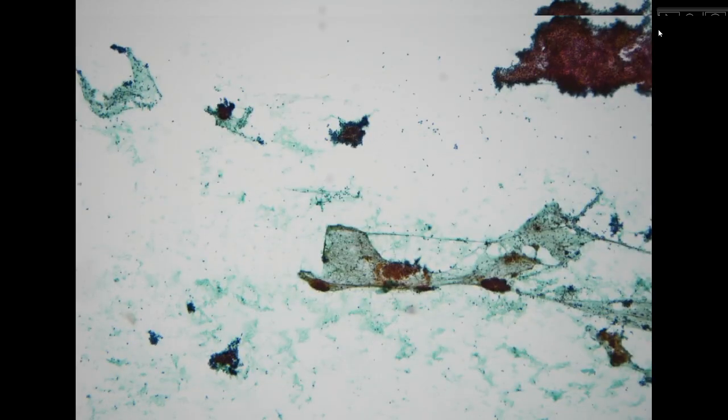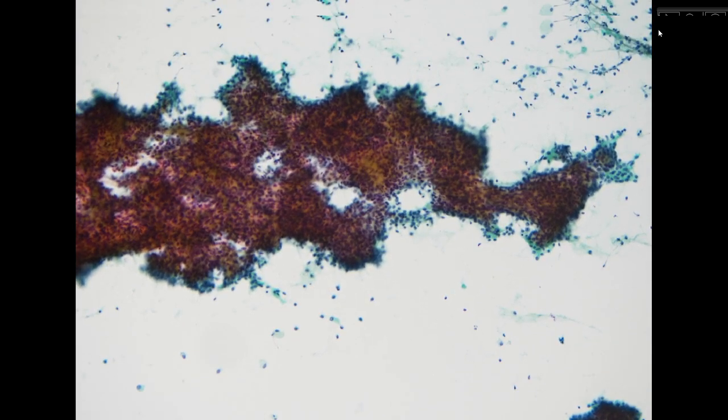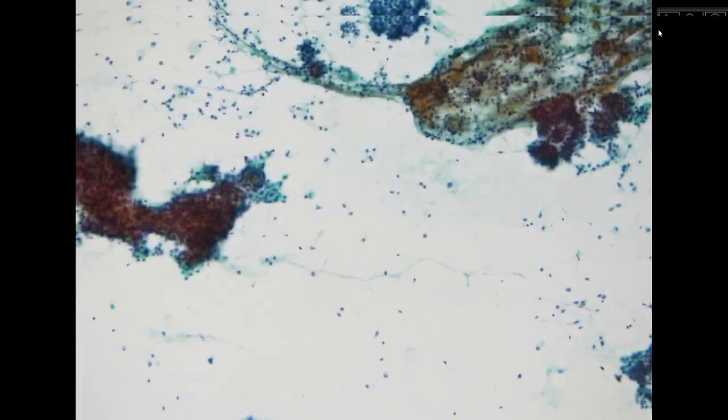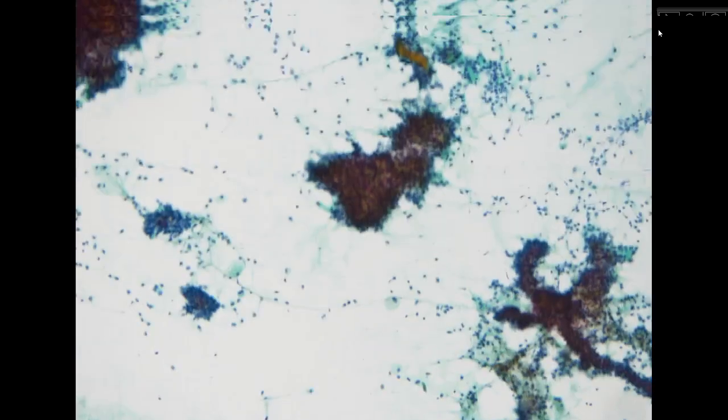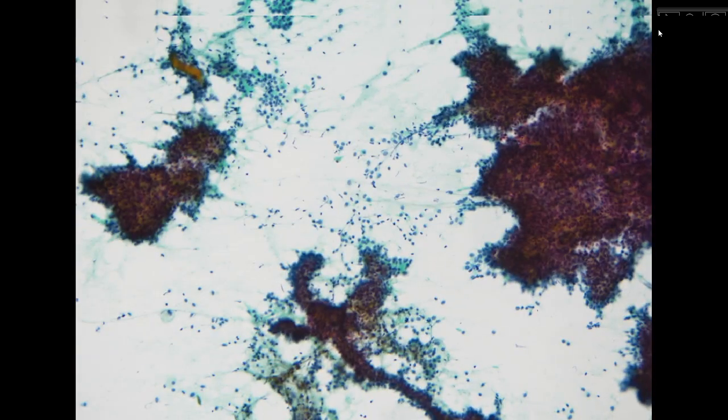Around 65% of the cases were benign. Among them, around half were basal cell adenoma, but the other half were pleomorphic adenoma with prominent basaloid features, or a cellular pleomorphic adenoma. So this is our differential diagnosis. Are we going to sign these out as 4A benign neoplasm or as 4B SUMP basaloid subtype?